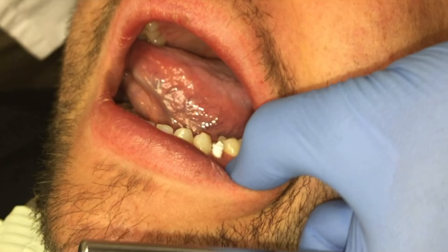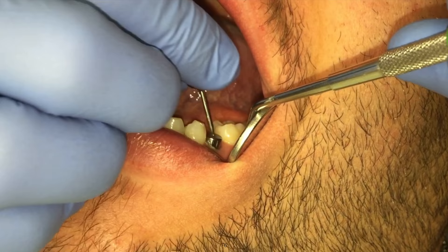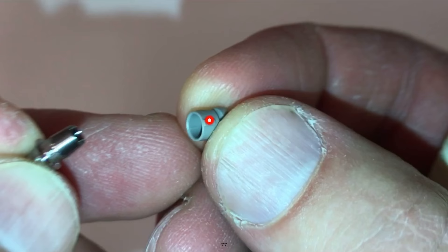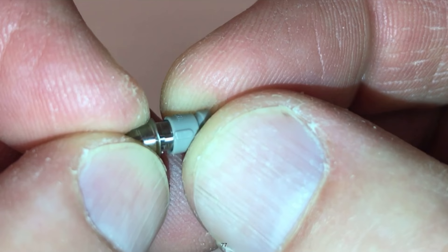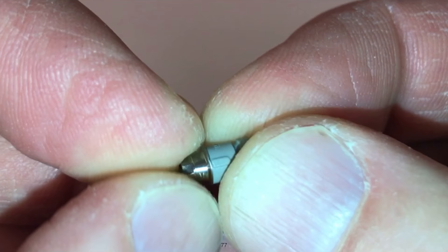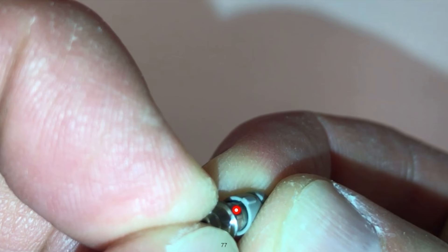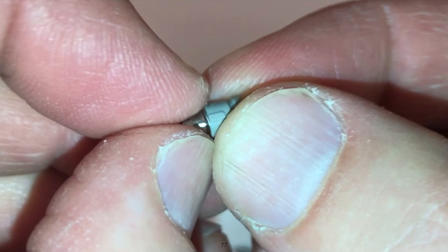Usually there's a little bit of force that's necessary. It should not be painful for the patient, but you're going to have to put some force to get it to slide down. This is an illustration of the internal notch. You can see that groove and then the notch right there. Those two should mate together perfectly. See how it slides together. They should mate into one another perfectly and then you have a flush mounting.